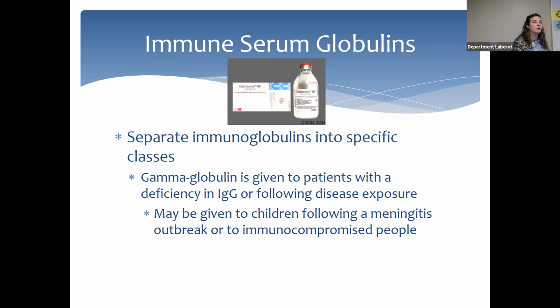You probably, if you're working with your clinicians, you want to establish a phenotype on them. So when this happens, you can give phenotypically matched, least incompatible units.